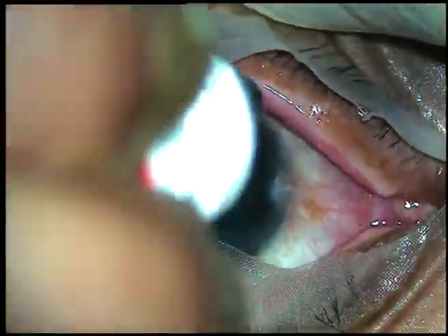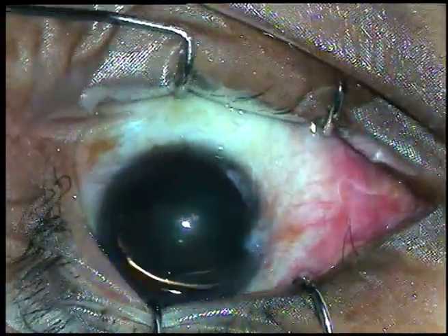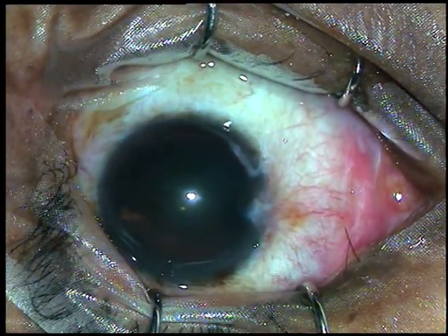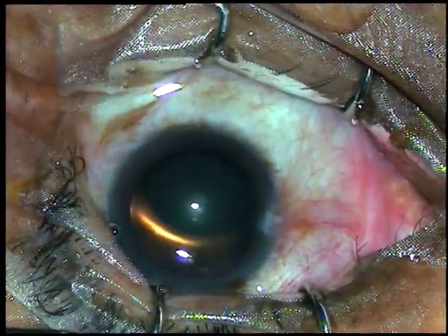The eye has been draped. The plastic drape is cut. Now, two to three drops of proparacaine are applied over the ocular surface. A speculum is applied in such a way that the lid margins are nicely covered and the eyelashes are not in the field. Some povidone iodine is applied and the ocular surface is thoroughly irrigated with balanced salt solution.